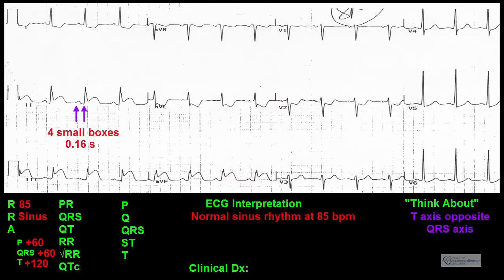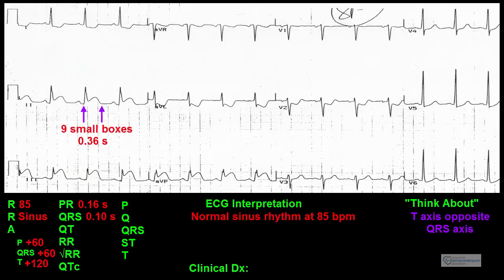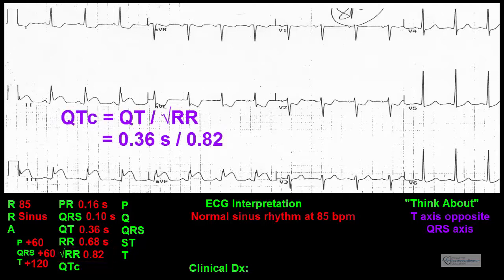Intervals: The PR interval is approximately 4 small boxes wide, or 0.16 seconds — this is normal. The QRS interval appears about 2.5 small boxes wide, or 0.10 seconds — this is also normal. The QT interval is 0.36 seconds. The RR interval is 0.68 seconds; the square root of 0.68 is 0.82. Using Bazett's formula, the corrected QT interval equals 0.36 divided by 0.82, which equals 0.44 seconds — a normal corrected QT interval for either gender.